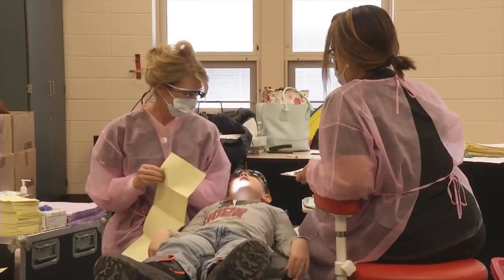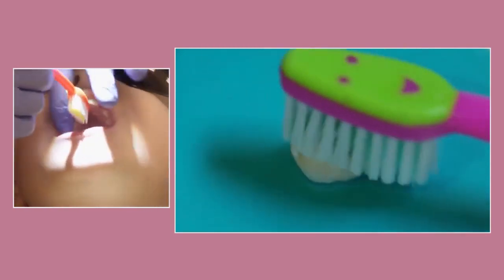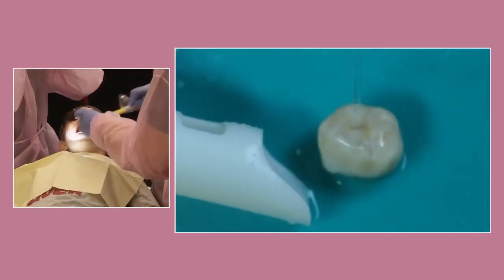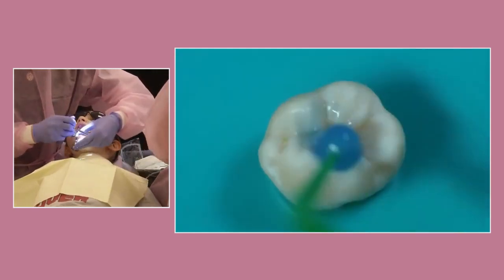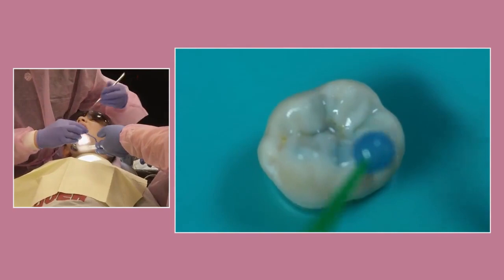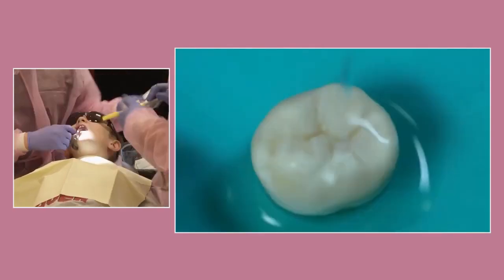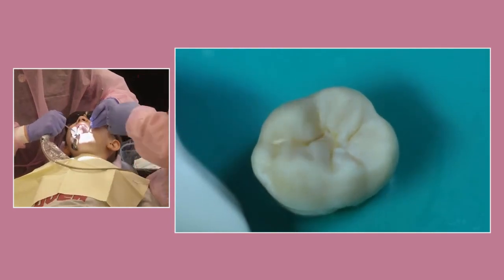Putting sealants on teeth is easy. A dental professional cleans your teeth with a toothbrush and then washes it off with water. Next, the teeth are dried and prepared with a gel or liquid that tastes like lemon juice. Then the liquid is washed off and vacuumed up before the teeth are dried with air.